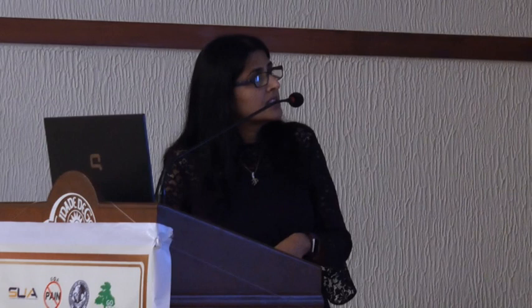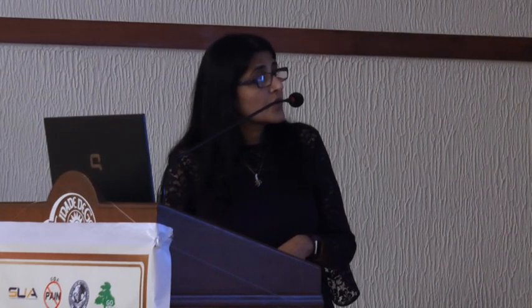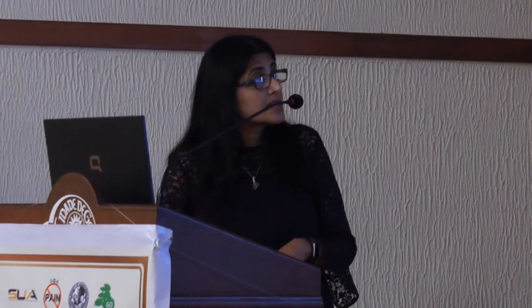The other structures you can see here are the posterior edge of the sternocleidomastoid, and you can actually see the superficial cervical plexus here as well. It's very easy to block that, depositing local anesthetic just deeper to the sternocleidomastoid underneath the fascia. This is the fascia, and this is the superficial cervical plexus.